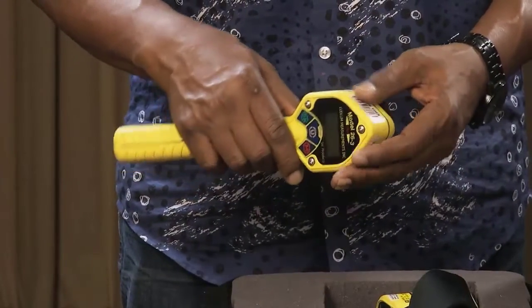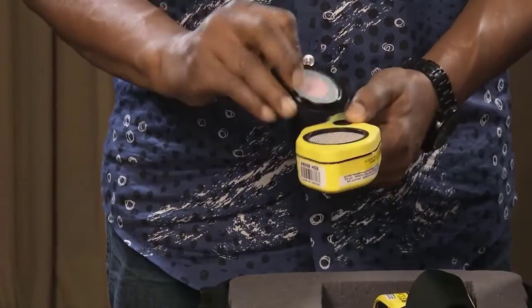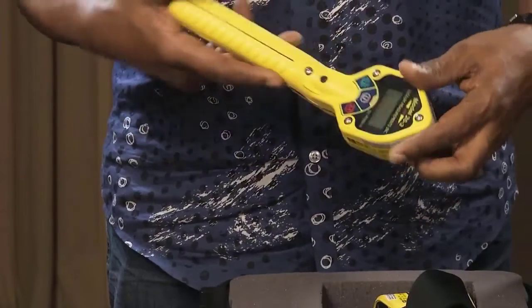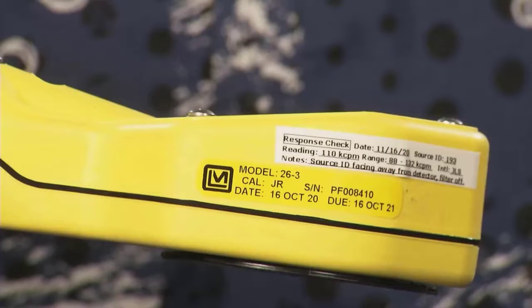Check for missing parts like screws, battery cover, and dose equivalent filter. If there is obvious external damage, missing parts, or evidence of internal damage such as loose parts moving around inside the detector, do not use the meter until any problems are corrected. Check the calibration sticker and ensure that the calibration date is current and that the serial number and response check ranges are readable.